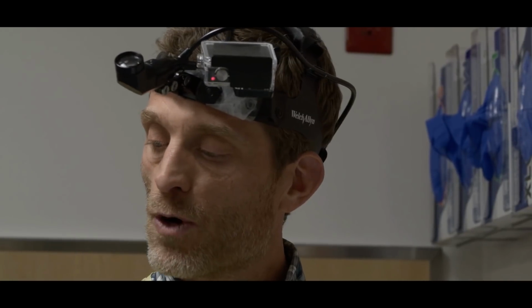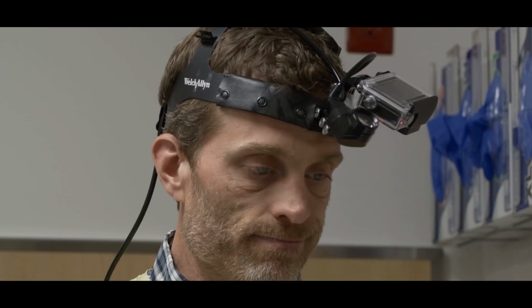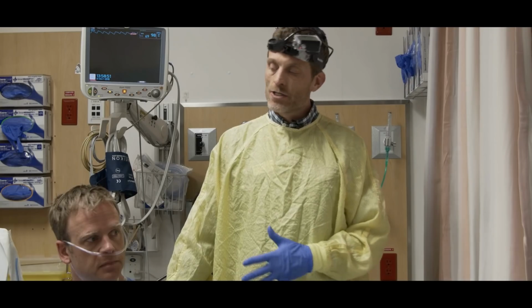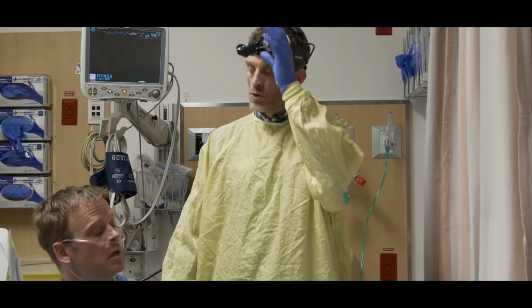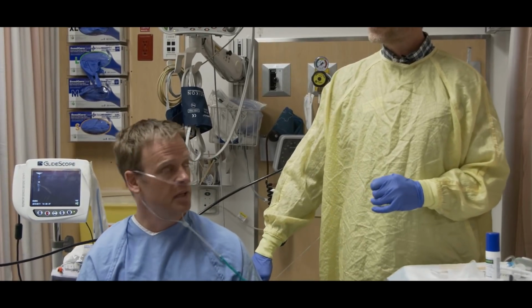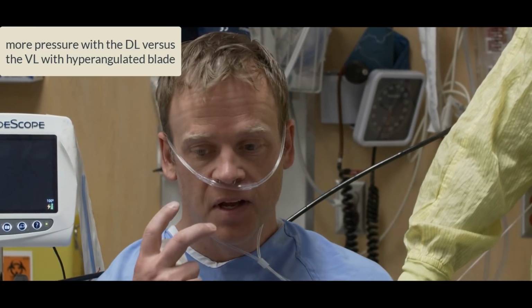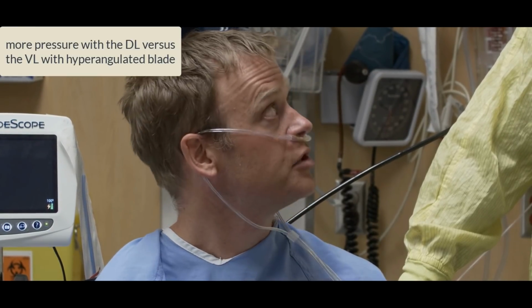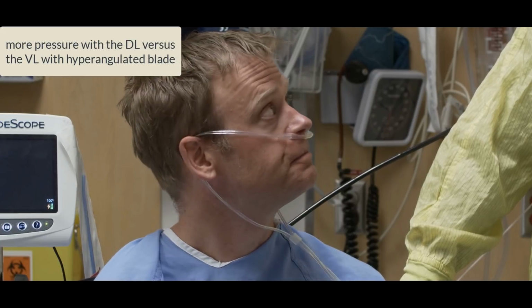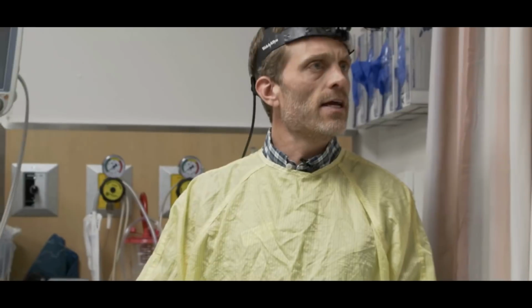Yeah, we had tons more room if we needed some more ointment for the back of the tongue. Chad, so what was the worst part? Just the pressure, I think. The pressure. So I think I was adequately numb, but there was some pressure. So I agreed that with some deeper topicalization, we probably wouldn't have had a problem. Yeah. Any other comments from the team?